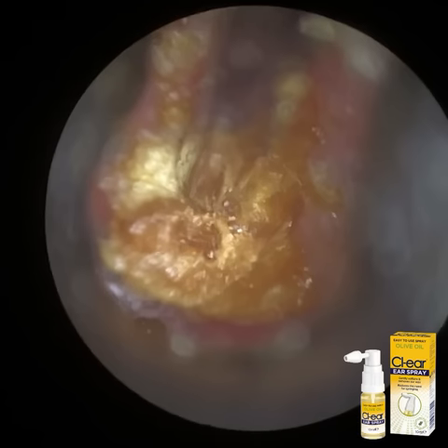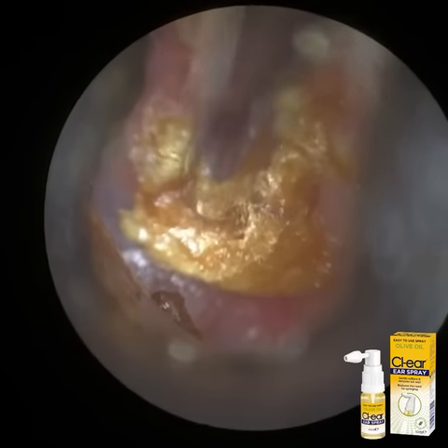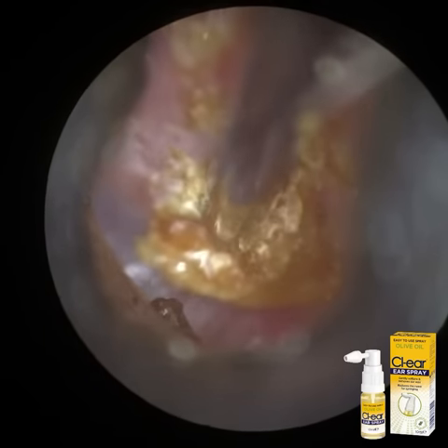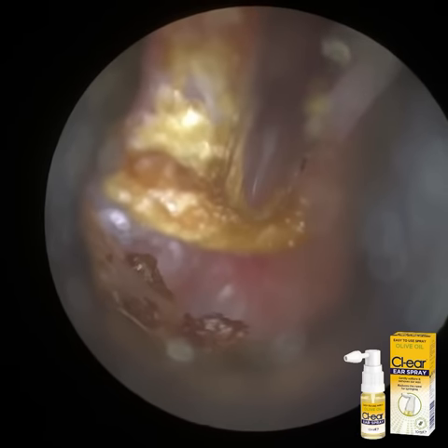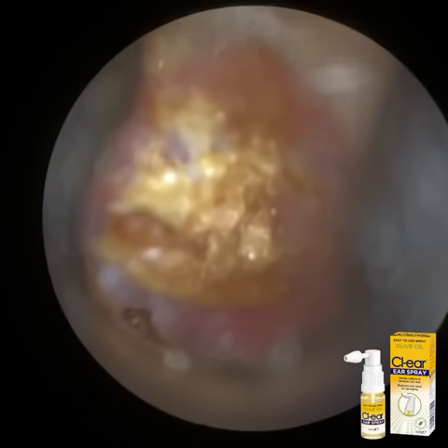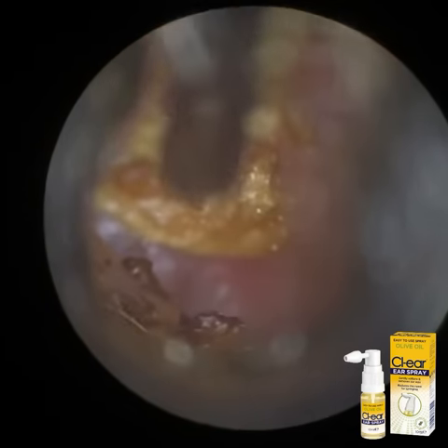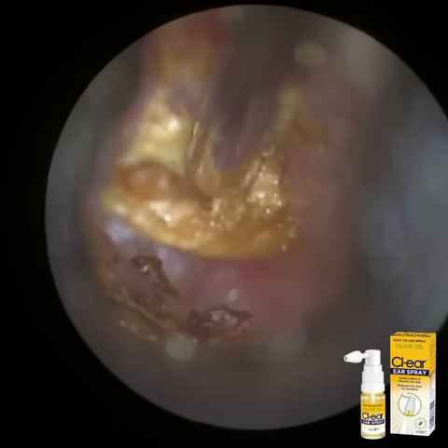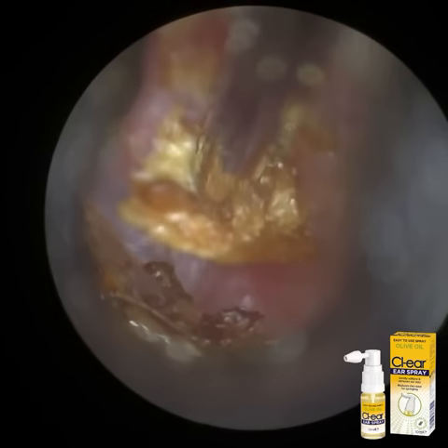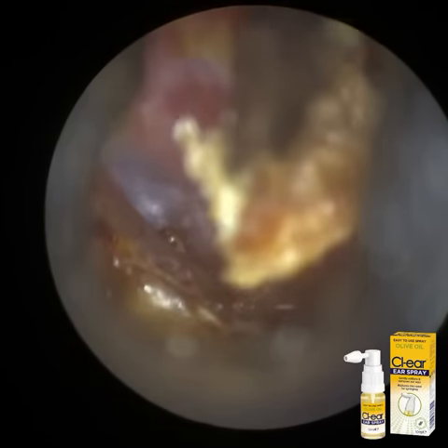So here I'm using a lot of the focus, really. I'm getting this dead skin. It is directly attached to the eardrum, and I'm just trying to loosen this and pull it away. When I've got it in focus, I know I've got the correct depth, so that's really useful. Again, I've just adjusted the focus slightly. It was strongly adhered, so this wax plug was impacted right up against the eardrum. I think I managed to peel it away on this occasion. There we are.